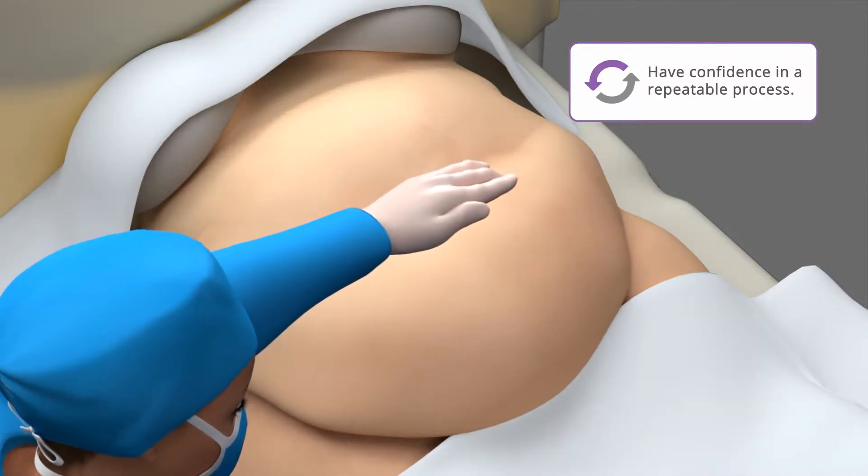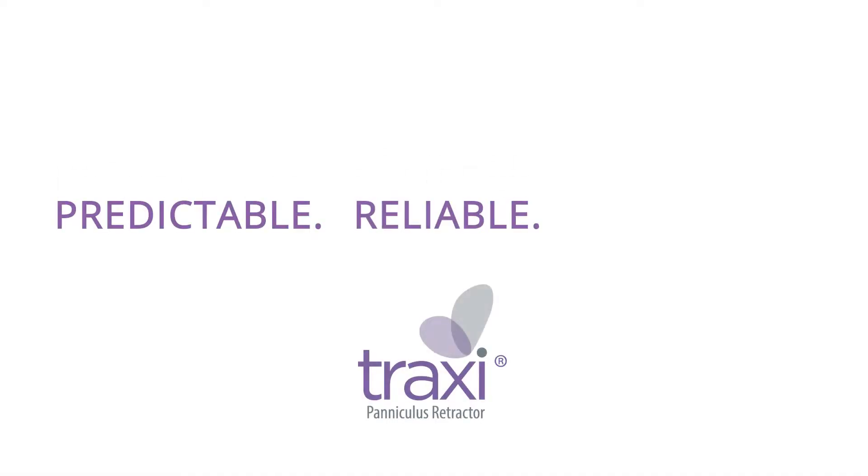With Traxi, you can have confidence in a repeatable process. Traxi offers predictable, reliable retraction.